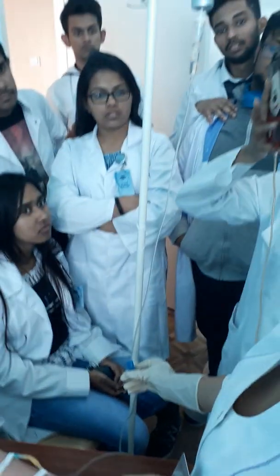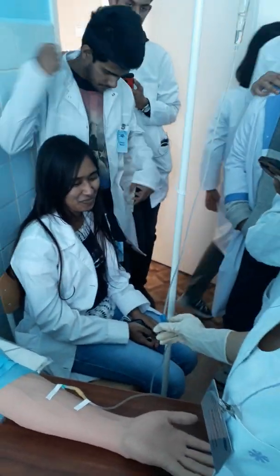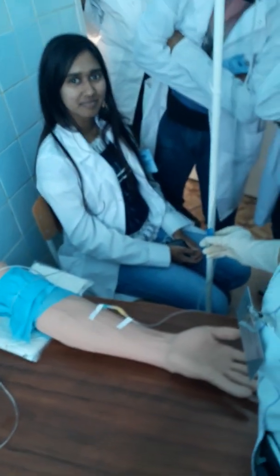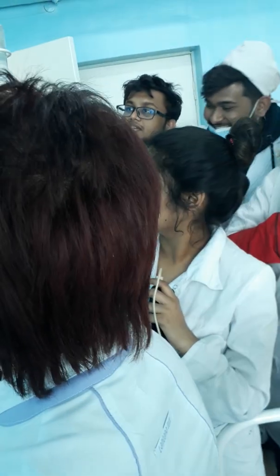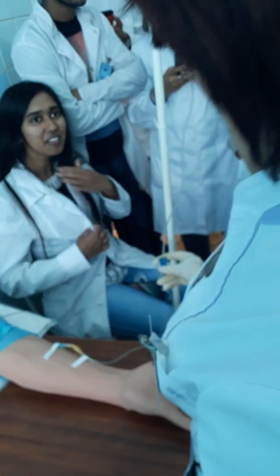Next classes I will give you a different task for each student, and every time you will regulate. For example, your patient needs the solution administered at 3 milliliters per minute. Maybe the speed is in drops, maybe in milliliters. Please count. 3 milliliters per minute.